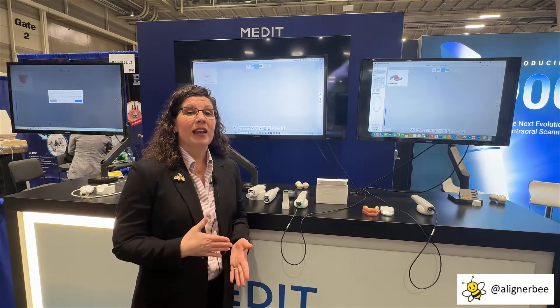I've had the Medit scanners in my practice since they released the Medit i500, and I've been using this scanner for quite a while with my orthodontic patients. When we moved from the Medit i500 to the Medit i700, we saw some changes, and even more changes today. Let's go ahead and take a look.